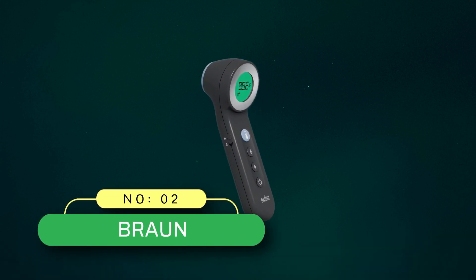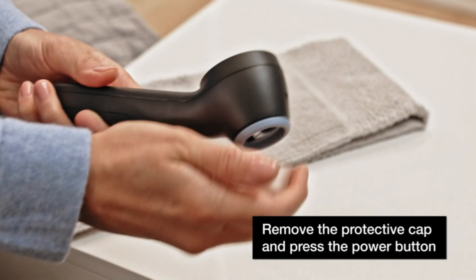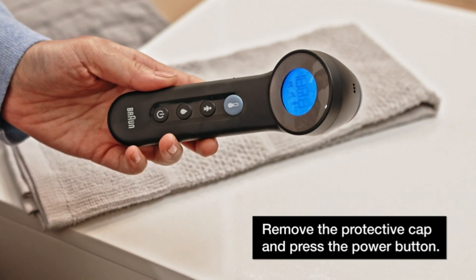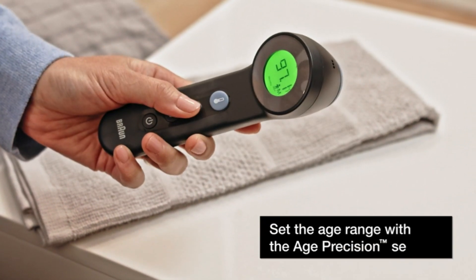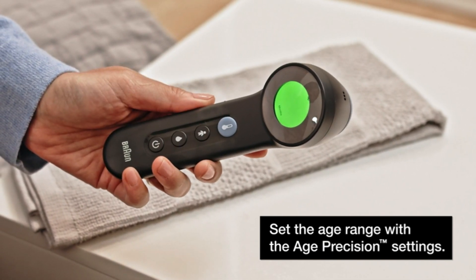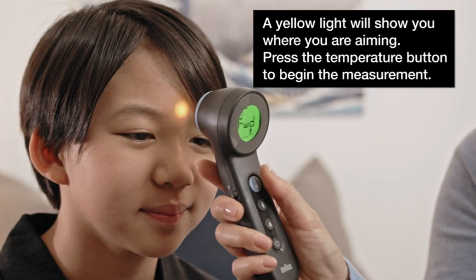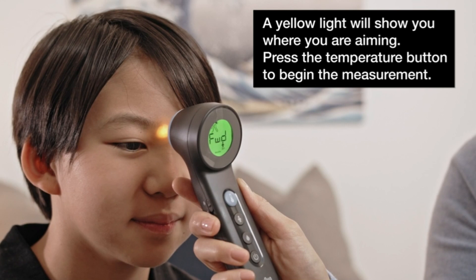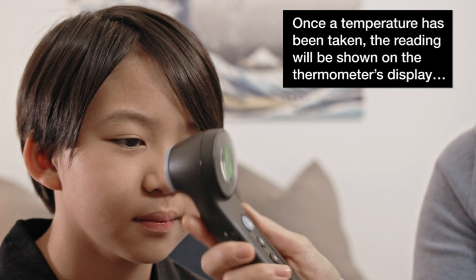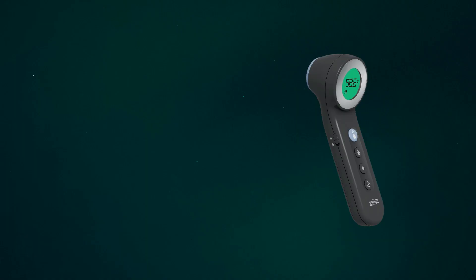Number 2: Braun contactless thermometer made in USA. This Braun 3-in-1 no-touch forehead thermometer allows you to take clinically accurate, reliable readings without waking a sleeping child. You can measure temperatures on the forehead or also on an object, bath water, or food. The on-screen positioning system confirms the proper distance, and a guidance light directs for accurate aiming. The color-coded display will glow green, yellow, or red to present the temperature reading.